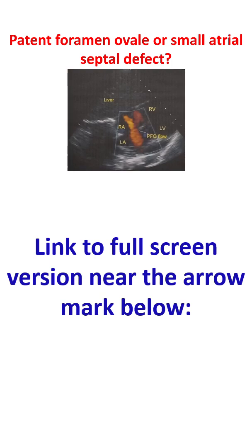If you see an echo dropout in the interatrial septum in the apical four-chamber view, that may be a false dropout. But if you see a dropout in the subcostal view, that will be a true dropout. So we have a defect in the interatrial septum, and we can also see a red color flow here.